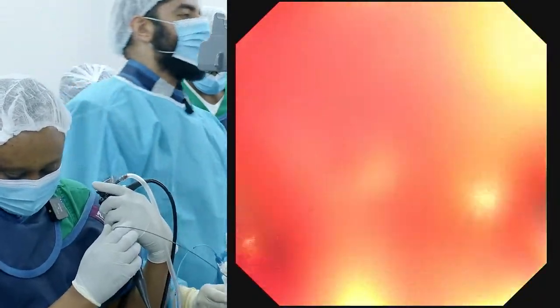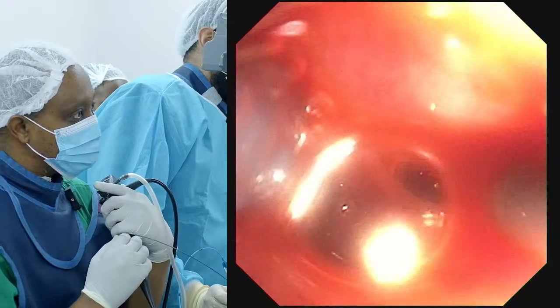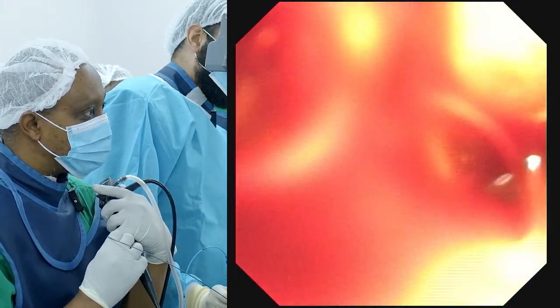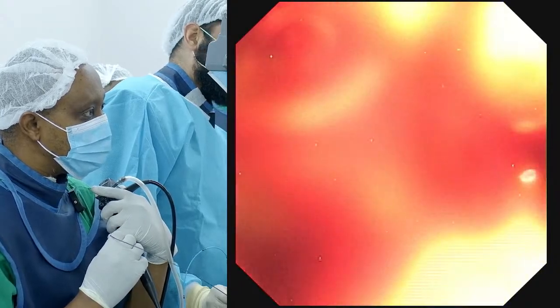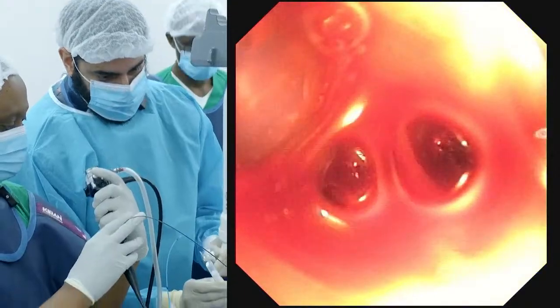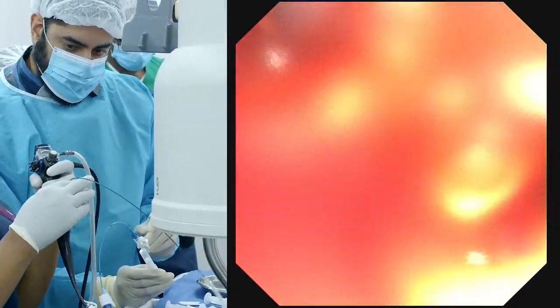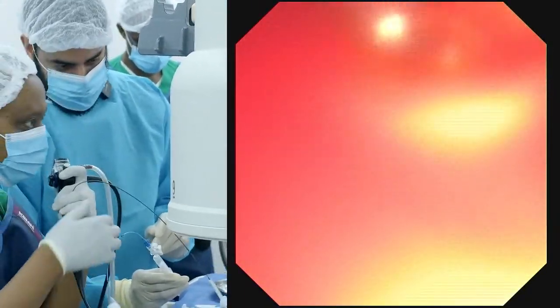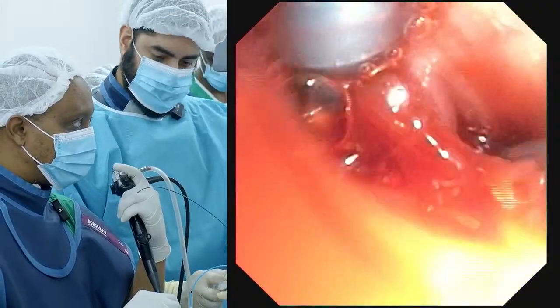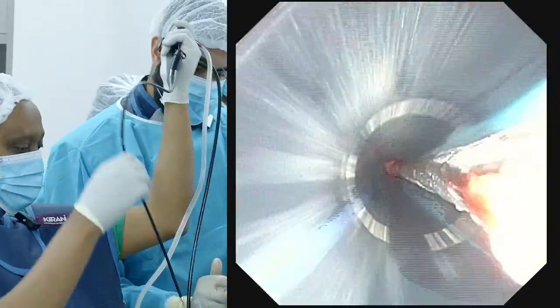Check fluoro. Yeah, pull back, maybe 2.5 centimeters. Yeah, that's not bad. Okay, I'm ready when you are. 1,001, 1,002, 1,003, 1,004, 1,005. Excellent.